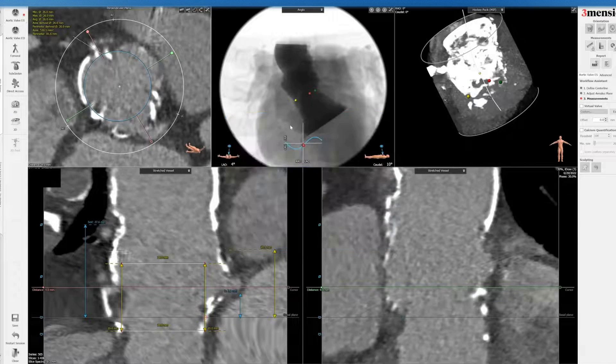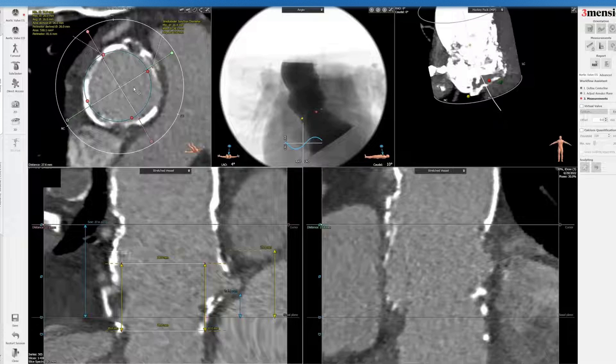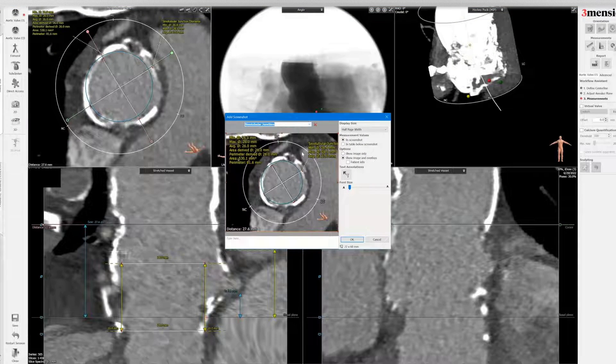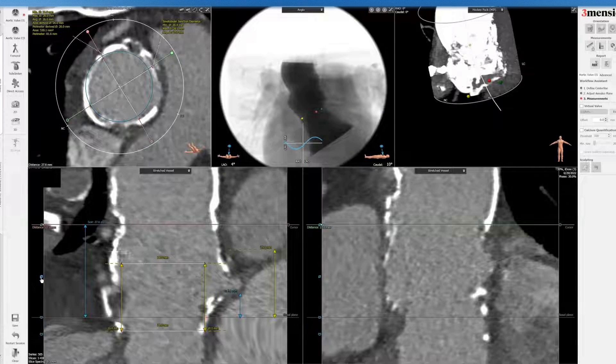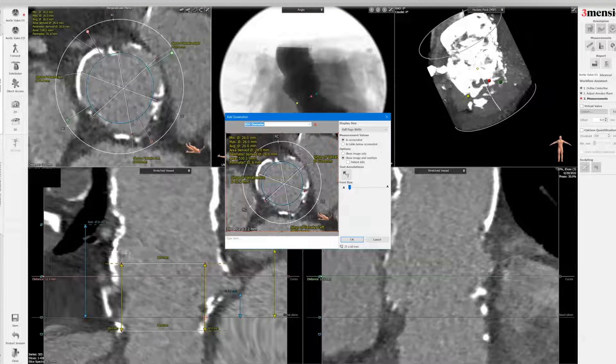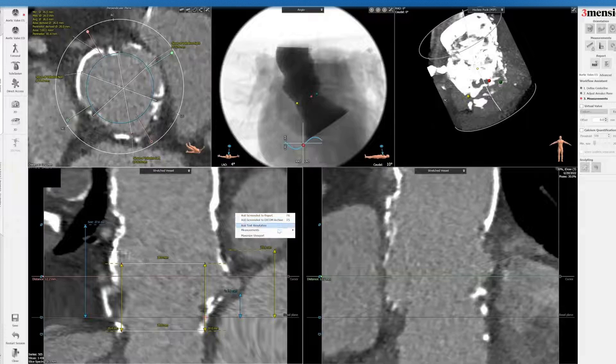The reason we look at the LVOT is that if the LVOT is enlarged, with a self-expanding valve there might be a risk of ventricular migration or movement on release — so that's something to keep in mind versus the balloon expandable valve, which is more consistent on deployment. Here's the STJ, just to make sure you're not going to injure it when you inflate the balloon with a balloon expandable valve or post-dilate. Coronary obstruction risk is typically low, but you have to be mindful of the STJ — if it's very small, you could still risk coronary obstruction.